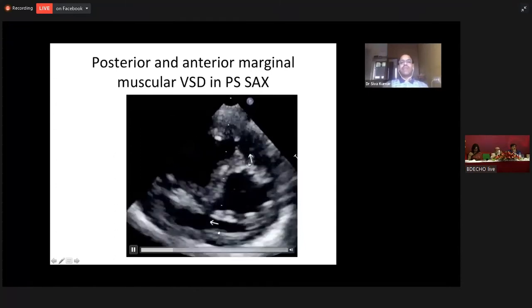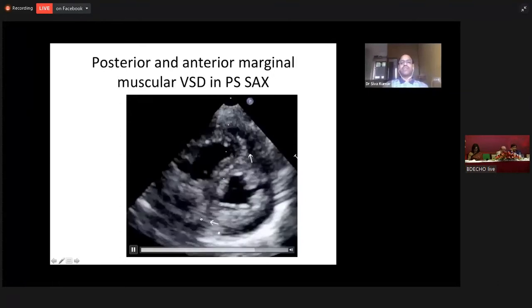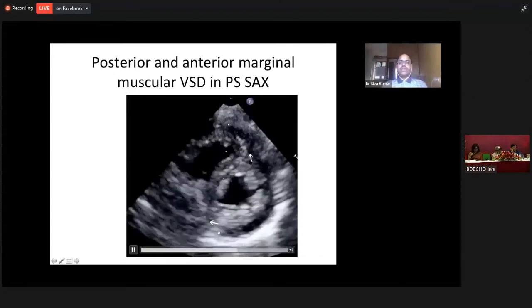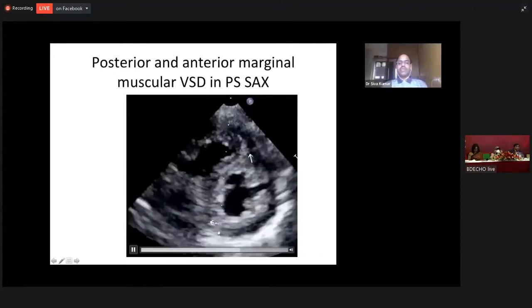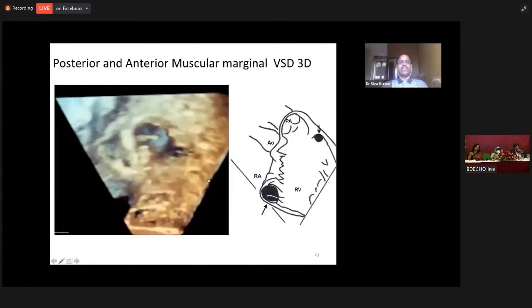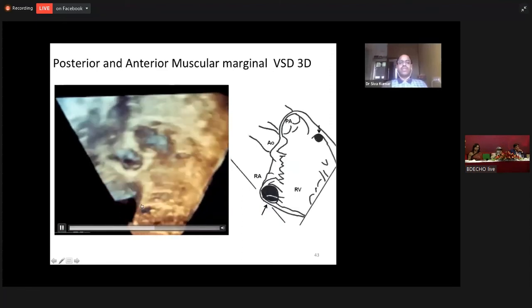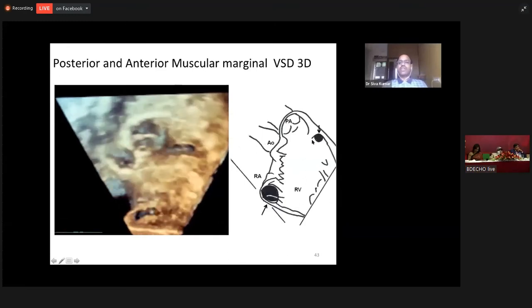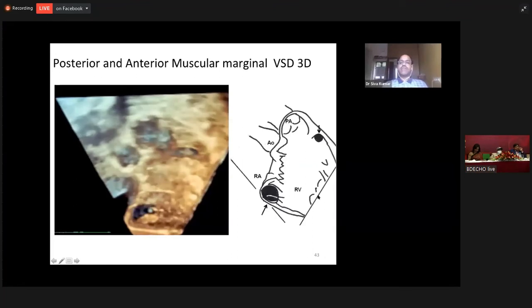These are examples of multiple VSDs. This is an anterior muscular VSD and a posterior muscular VSD, seen on a parasternal short axis view. The anterior muscular VSD is smaller and the posterior muscular VSD is larger. When you look at it on a 3D en-face view, the anterior muscular VSD and posterior muscular VSD are both visible. I have drawn a cartoon here — this is the muscular hole of the ventricular septum with anterior and posterior muscular ventricular septal defects.